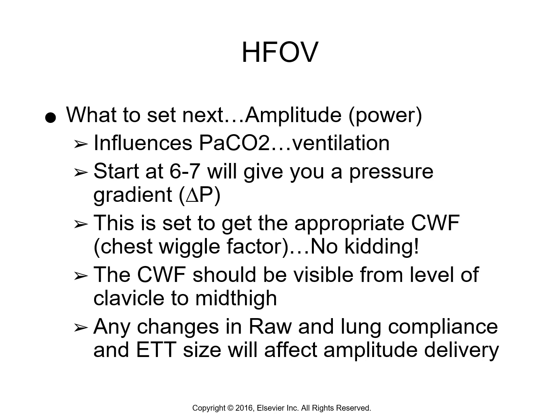So also that is what controls the level. Also, if you have to, you can adjust this power level to mess with your PaCO2 if you need to. Any changes in your airway resistance, your lung compliance, and your ET tube size will also affect the amplitude delivery, so keep that in mind.